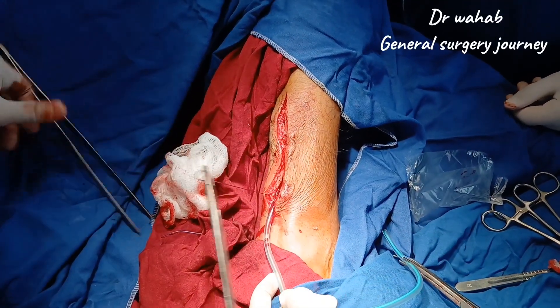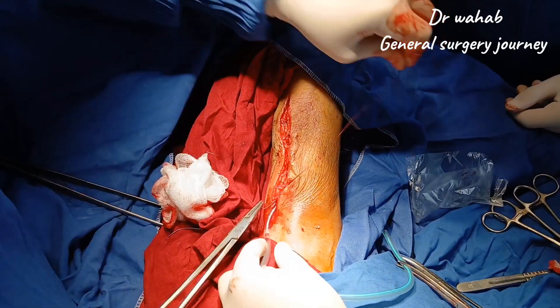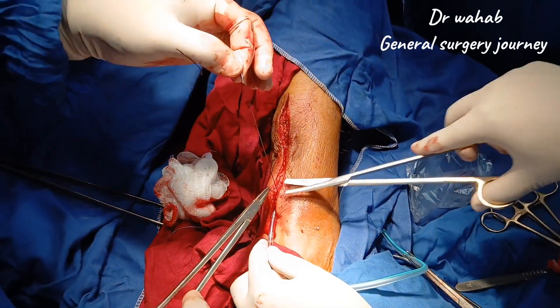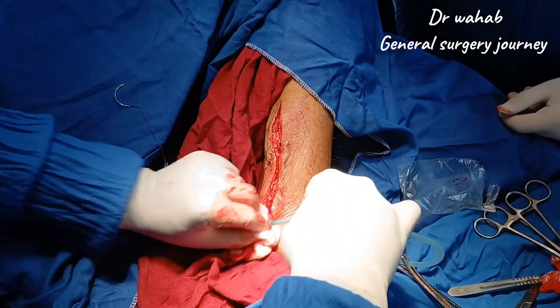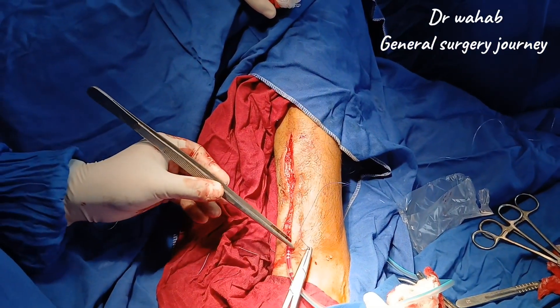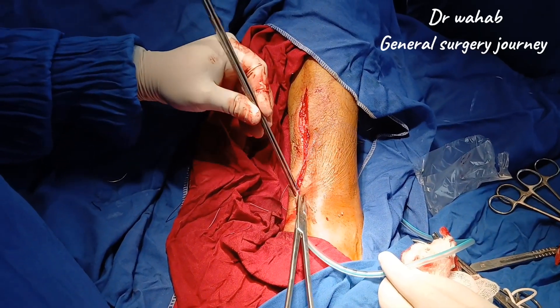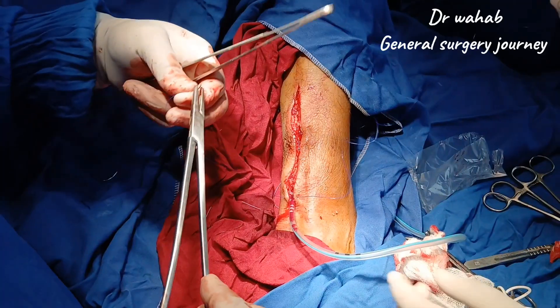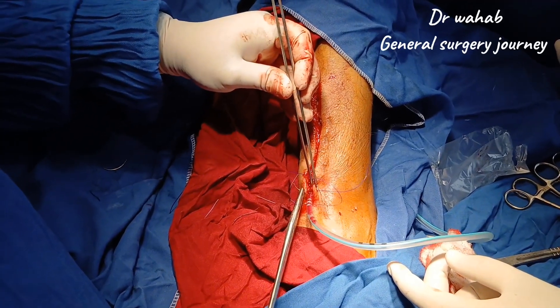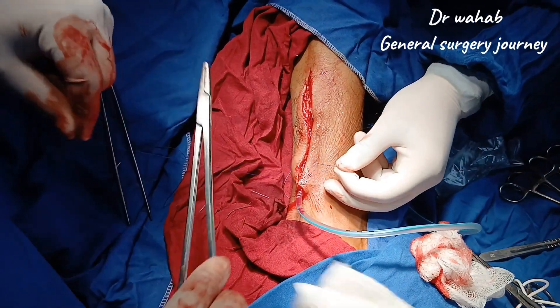Now we will fix a redivac drain at the lower margin of the incision to allow smooth drainage of serous fluid during the post-operative period. The drain will help prevent fluid collection and promote proper wound healing. It is secured with a silk suture to avoid accidental displacement. Now we will close the skin with interrupted vertical mattress sutures using non-absorbable suture.